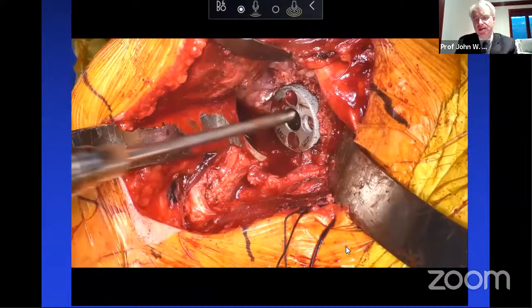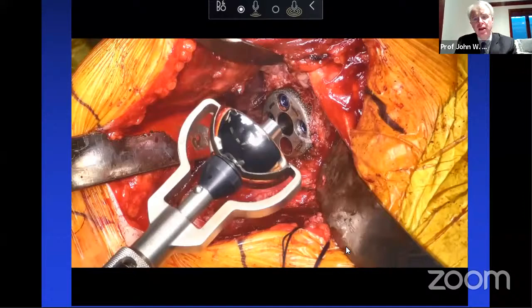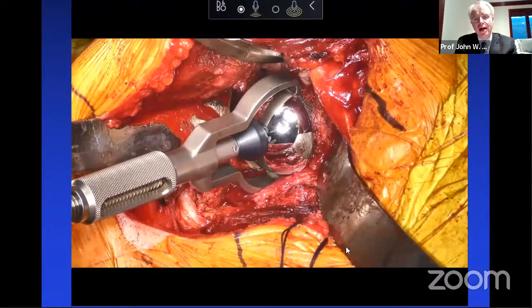And then we'll fill these in with the locking screws. And I like, in a bigger patient, to go to a 40 glenosphere. This is a smaller patient, 36 glenosphere. We'll dial it a few millimeters below the bottom part of the glenoid. And then we'll adjust that retractor the way we would like to improve our access to get the glenosphere down.